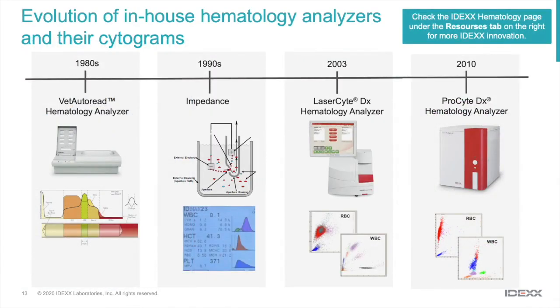Over the years, there's been an evolution in hematology analyzers, giving us more and better data. Throughout that evolution, there's something that we have completely ignored, and those are the graphics that come with each result that you do. Those graphics actually tell you how the analyzer performed on that particular patient sample. And once you learn how to use these, you can verify the numbers without having to go to a blood film. Now, each manufacturer should be able to provide you with some guidance.